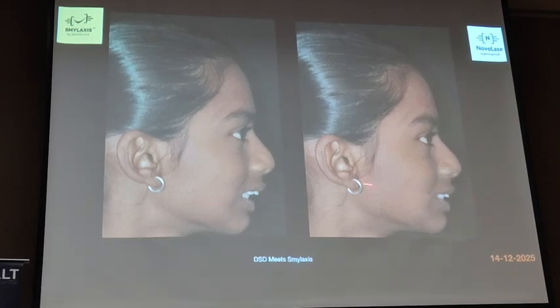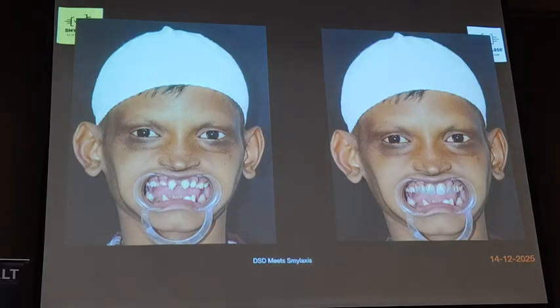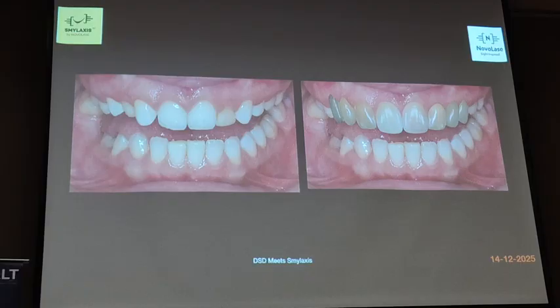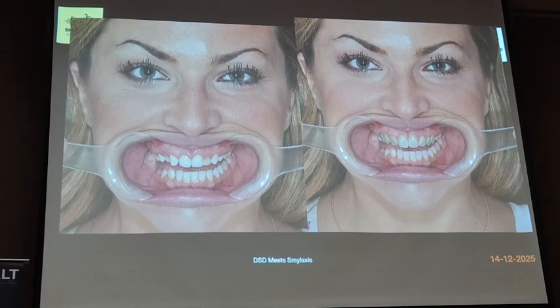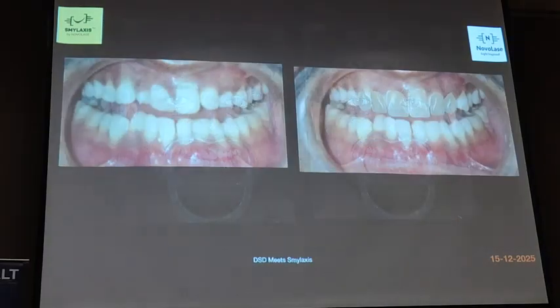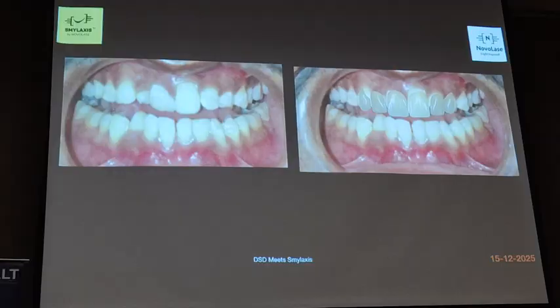You want to look at this case, she came like this. Actually, we just showed with the DSD image, she agreed for the mandibular advancement therapy. Like that. So, our syndrome case, I'll just brush through. There are different cases with how you can convince for the digital smile design. Will not waste time here.